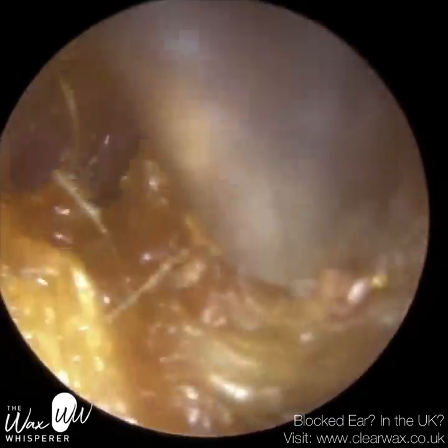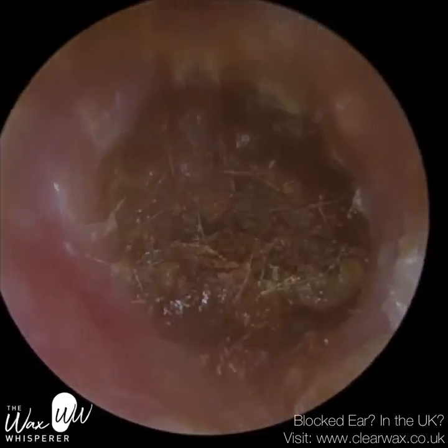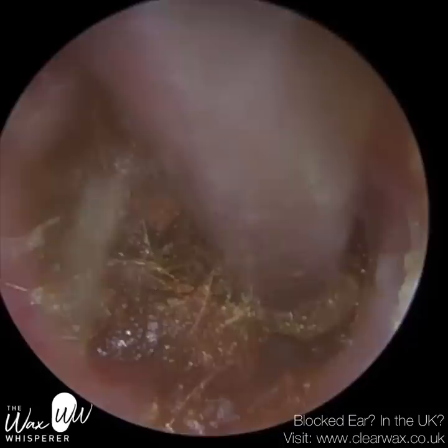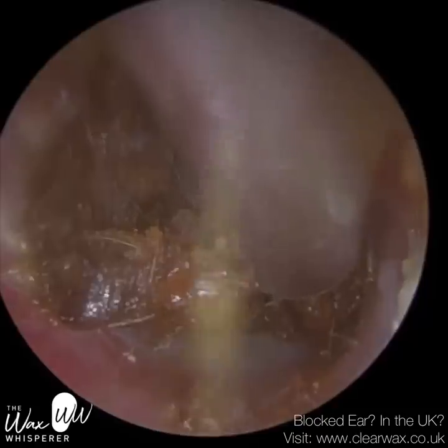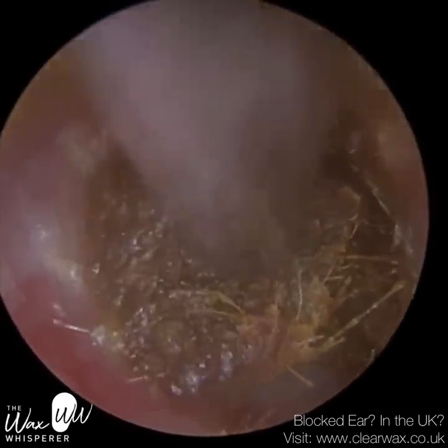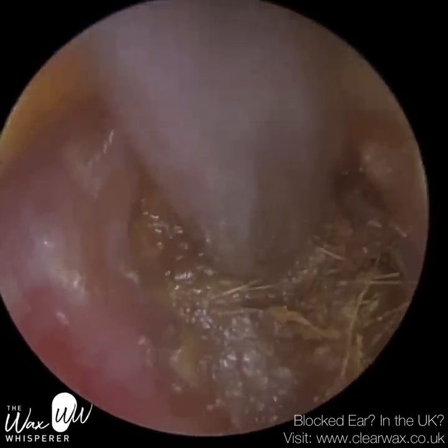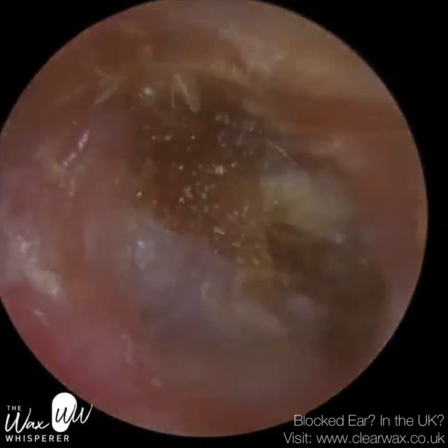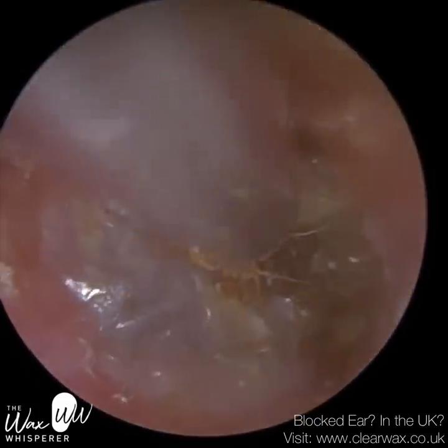As you can see in this ear there's considerably more wax and a more severe impaction. On the left side the plug came out in one large piece. You can begin to see the eardrum, and this section of the ear canal — I don't know if you can notice — is wider than the rest, and I would say abnormally wider. That's a sure sign of keratosis obturans. With keratosis obturans you get different textures and consistencies: sometimes it's soft and smudgy like this, sometimes really hard and crusty, and sometimes very elastic.